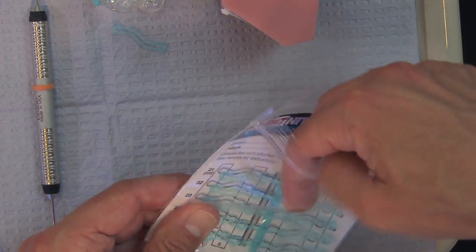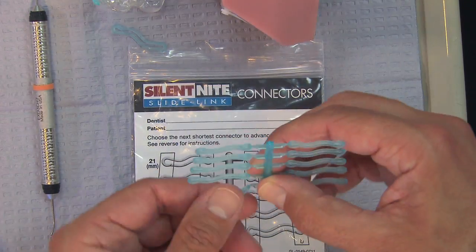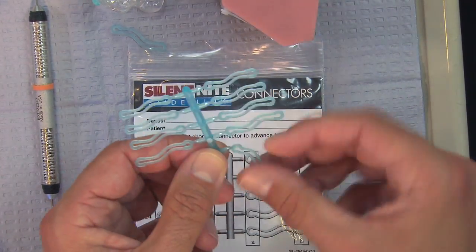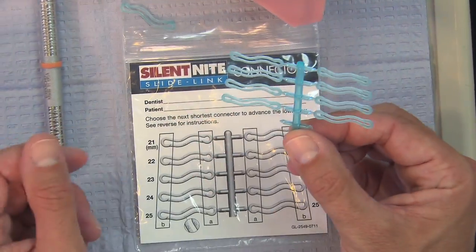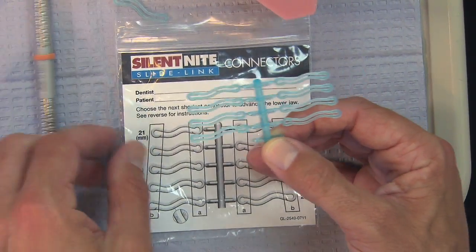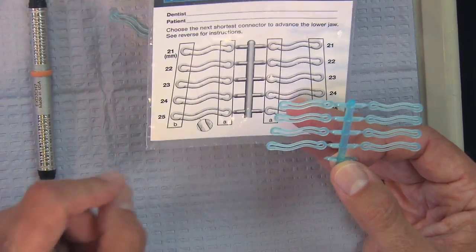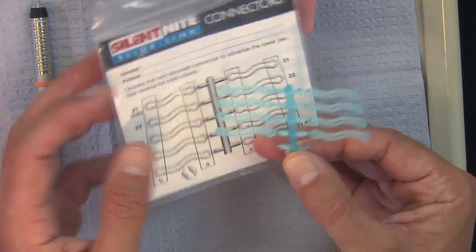When you give this to the patient, the 25 millimeter connector will already be off of here. This is the default one that gets used on the appliance when it's shipped from the laboratory. So when you receive the case, it will look like this with the 25 millimeter ones gone. They'll already be on the appliance. And so if the patient continues to experience symptoms and they're snoring and it's been a week or so, you can have them move up to the next one, to the 24 millimeter ones.